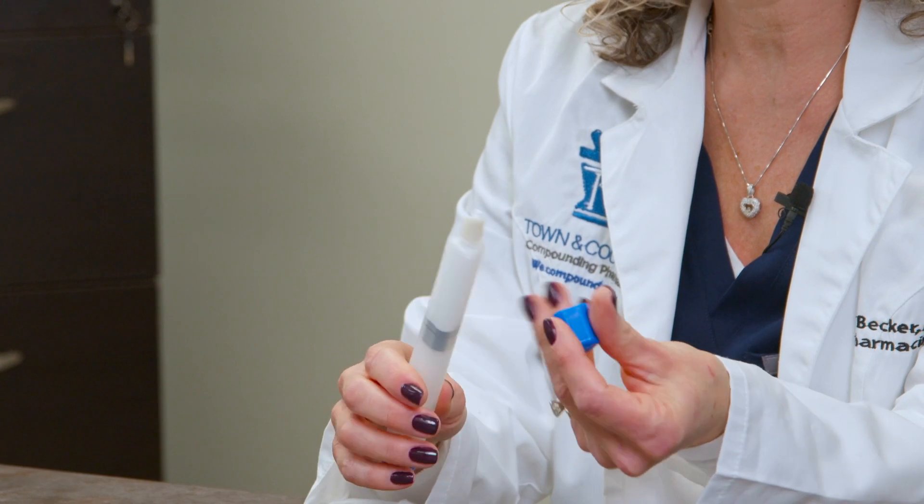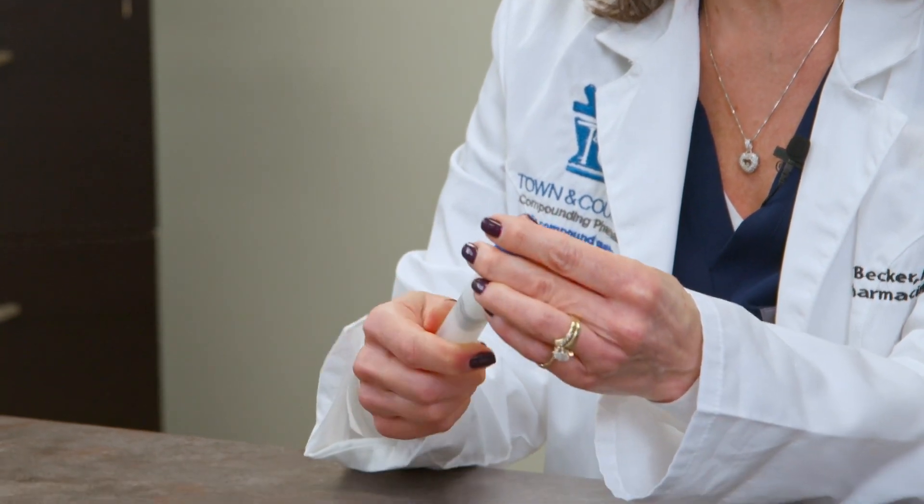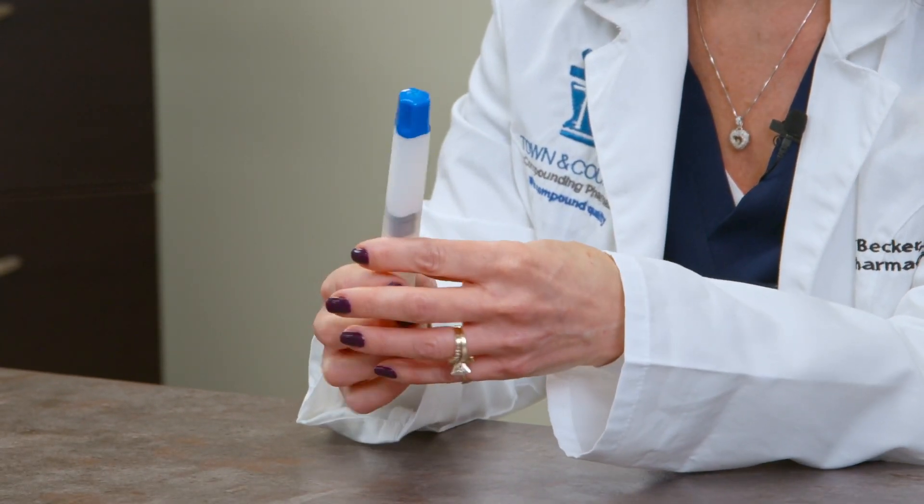After you've completed using the cream, make sure to put the cover back on tightly and to wash your hands thoroughly. Cream can be transferred to other people, to articles of clothing, to young children, to pets. So it's very important that you wash your hands thoroughly and that the area where you've applied the cream stays covered. If you're going to bathe or swim, please make sure that you wait at least an hour after applying the cream before you do so.